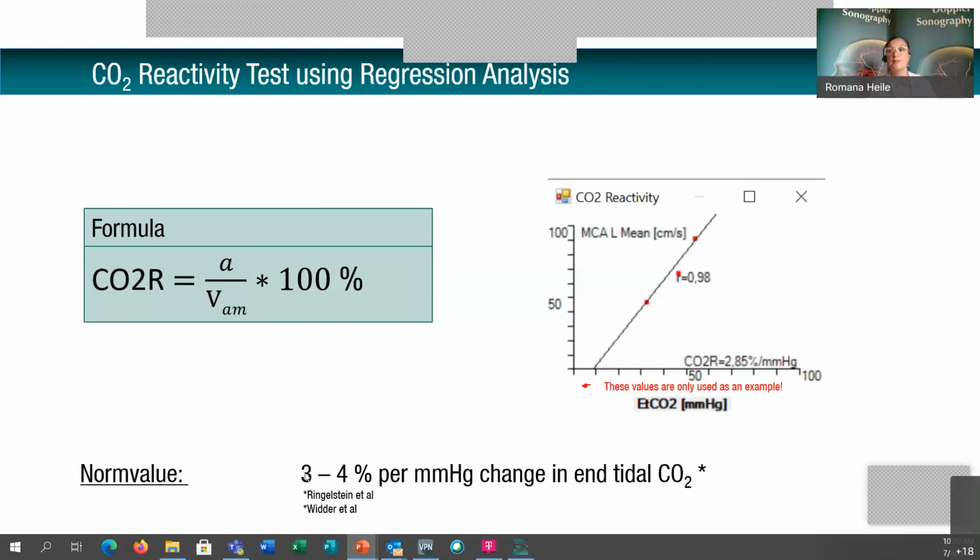If you do just one single thing different than described, then the normal value, of course, will be different. Therefore, it's always important to create lab-owned norm values by continuously repeating the same test procedure with normal volunteers.